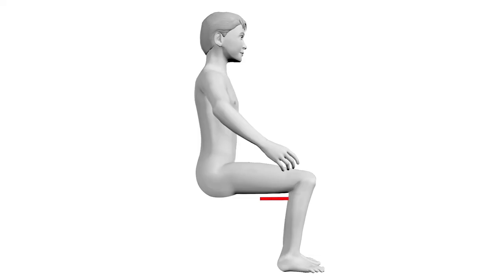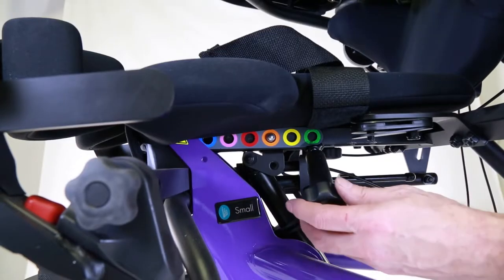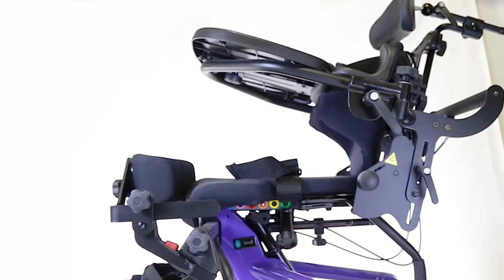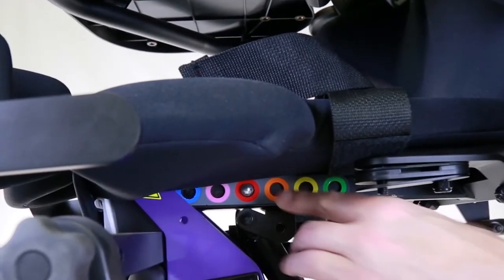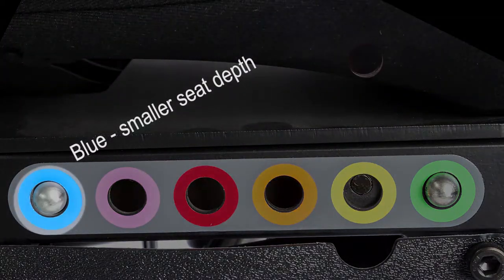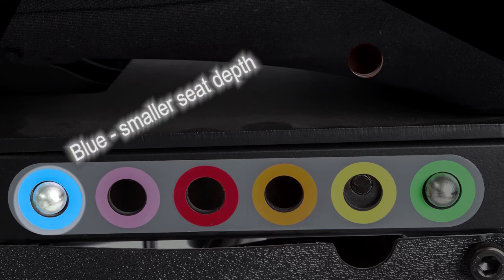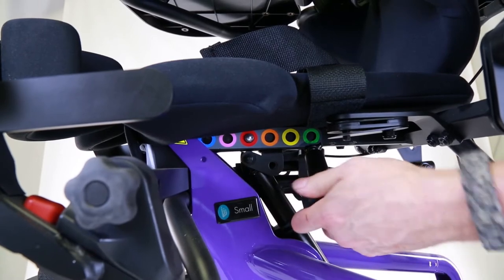Step 2: Adjust the Seat Depth. Using your seat depth measurement from your child, adjust the seat depth of the stander — this measurement is from the front of the seat to the seat back. To adjust, loosen the tightening knob under the seat, then with one hand supporting the back, depress the spring button on the left side of the adjustment tube. Moving the snap button towards green will give you a larger seat depth, and moving towards blue will give you a smaller seat depth. After the correct seat depth is achieved, secure the tightening knob.